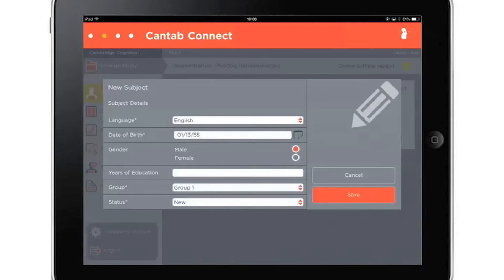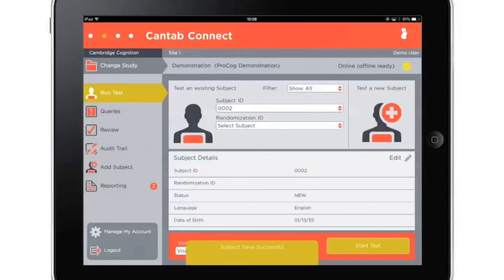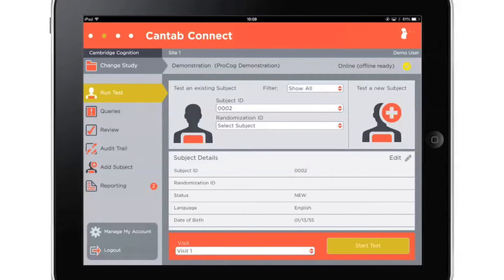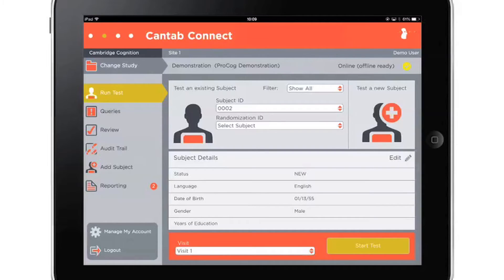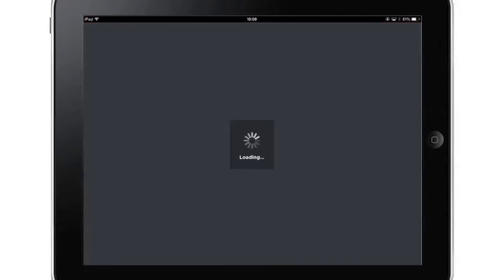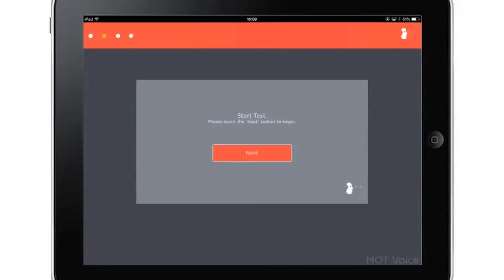Once subjects have been created, they are ready for testing. The drop-down list allows subjects to be selected if created ahead of their first visits, or to select subjects who are returning for subsequent visits. The list can also be filtered to make it easier to search for subjects in large studies. Details of the selected subject will then be displayed and the testing session can begin.